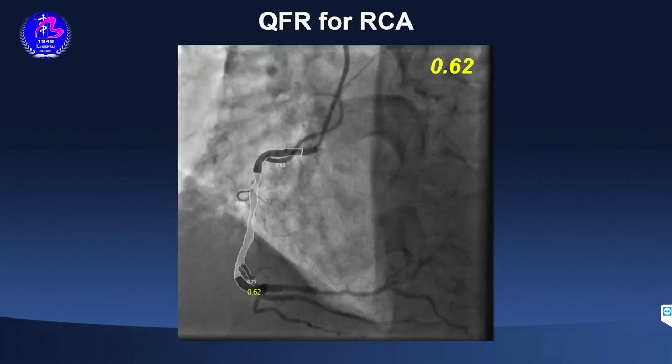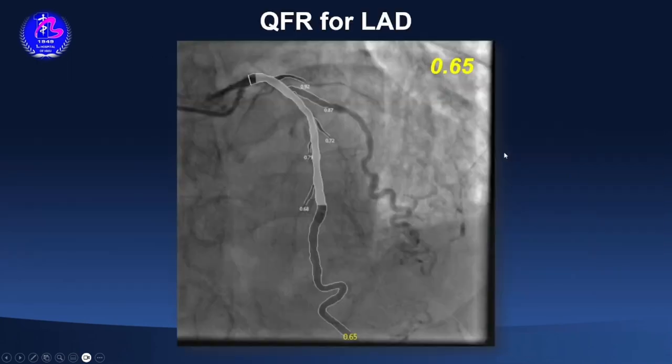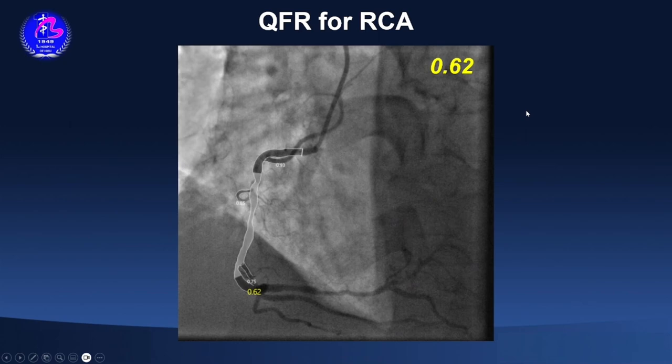Next. Due to the epidemic, the patient's complete revascularization was delayed after his discharge. Next. Before the operation, we conducted a QFR examination on the patient. The QFR of LAD was 0.65. Next. The QFR of RCA was 0.62. Next.